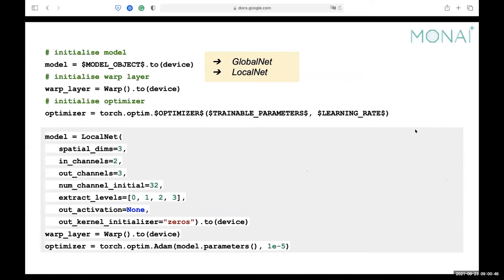Before training, we need to initialize our model, warp layer, and optimizer. In MONAI, we have implemented two models specifically for registration: the GlobalNet and the LocalNet. The GlobalNet can predict an affine transformation — rotation, shearing, translation, and scaling for the whole image. The LocalNet is for predicting the DDF, giving a three-channel displacement prediction for each pixel. We also need the warp layer, which warps the moving image using the predicted deformation to get the warped image. In this example, we are using the LocalNet.